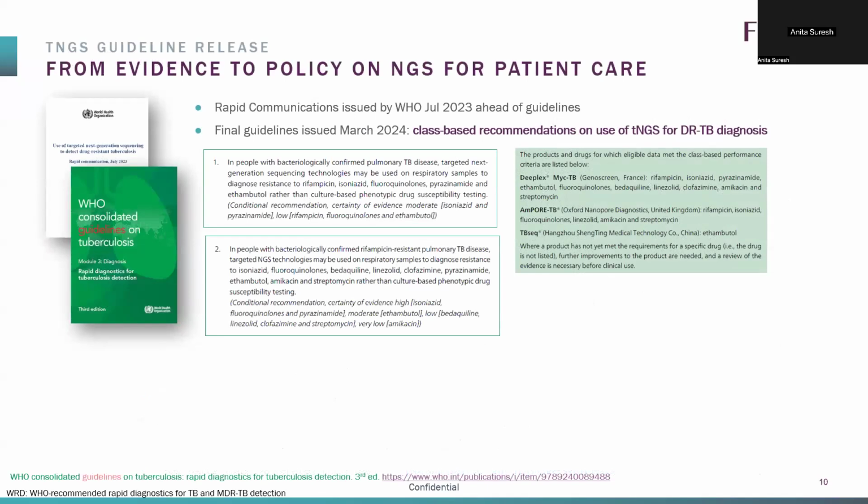So putting together all of that, there's a lot more detailed data. If you're interested, the publication will have all of those details for you to look at. But the key here was taking that evidence to WHO, for a very rigorous guidelines development group review last year. It took several months to get the final guidelines published, but at least there was a rapid communication right after saying this had been reviewed and this is a positive recommendation.